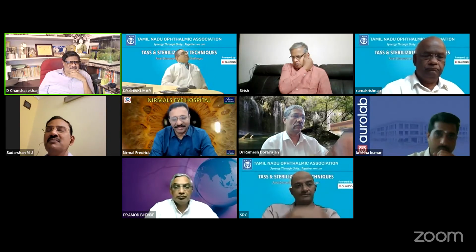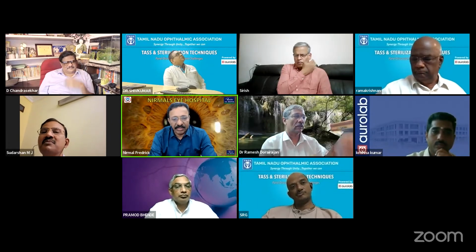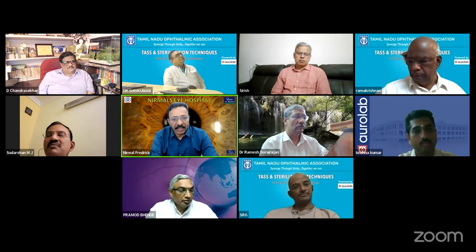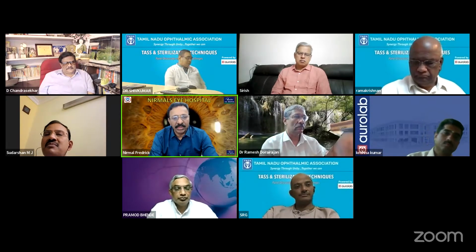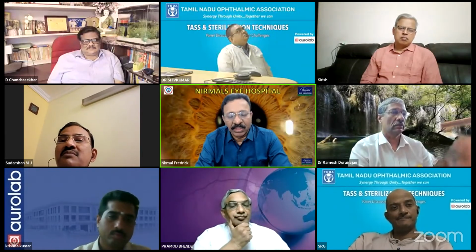Yes, Nirmal? I think Shivkumar has rightly put this. The manufacturer's recommendation for usage applies not only to reusable but also single-use devices, plus the consumables and sharing of consumables. Now most of the insurance companies are also asking what are the reused consumables as well as single-use consumables. They also want a declaration that we have told the patient about the reusable nature. So it's becoming very complicated medico-legally as well as from the insurance aspect.